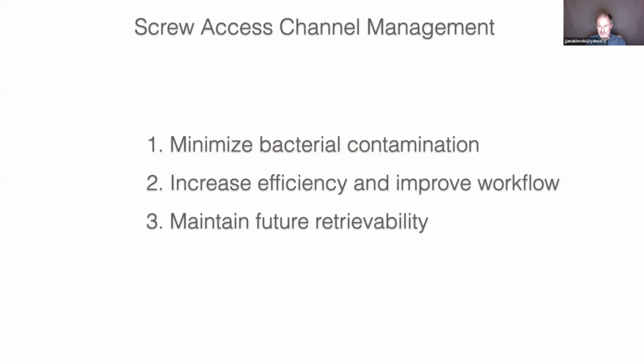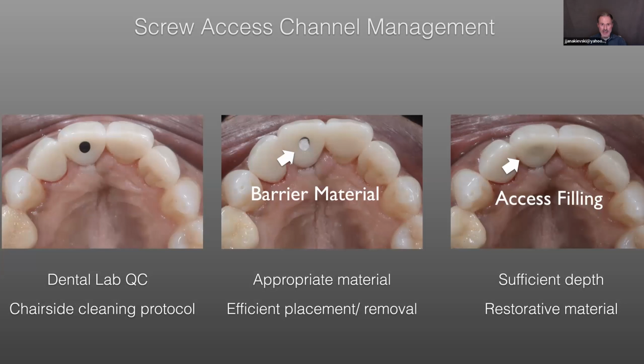And I'll explain that to you a little bit more. Screw access channel management is something that wasn't really talked about so much. We just started doing things in our practice. This is a bigger picture discussion: we need to talk about how we minimize bacterial contamination in the implant abutment interface, how we manage our restorations when we install them, how we can improve our efficiency and our workflows when installing these restorations, and how we maintain future retrievability. So what do I mean by screw access channel management?